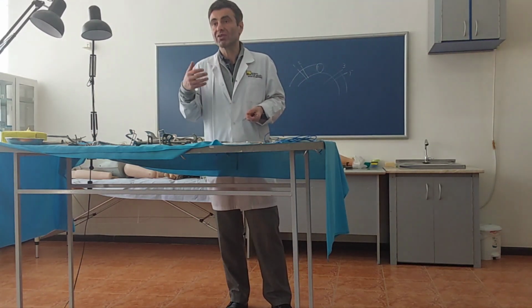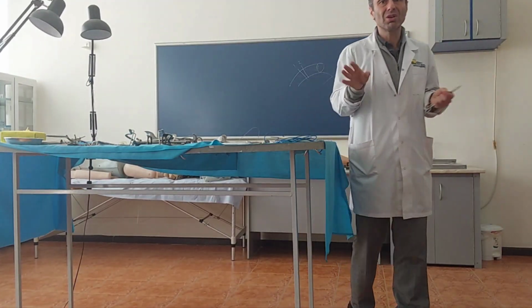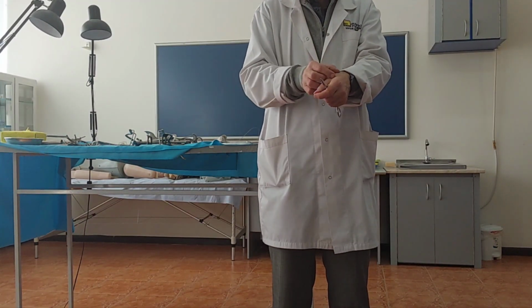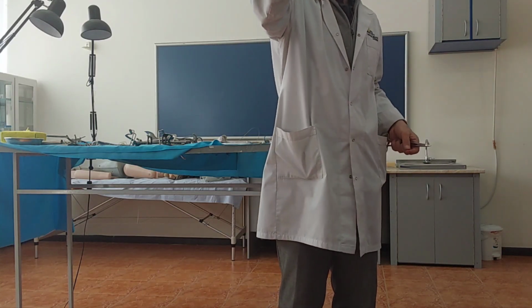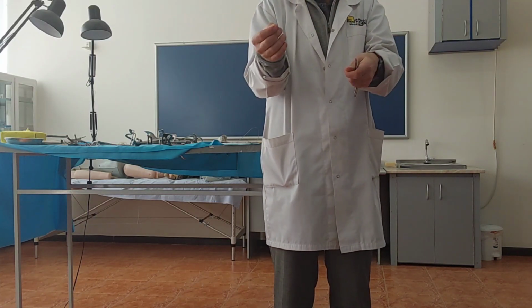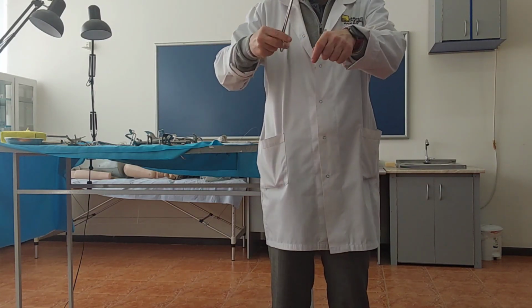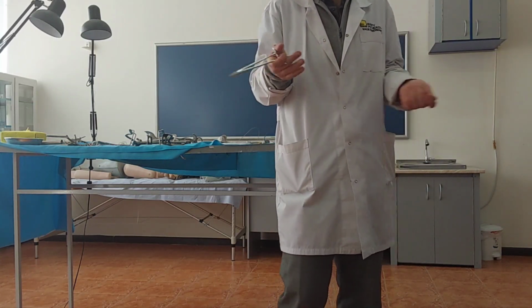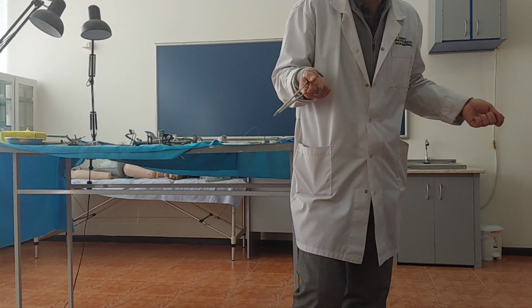In same case, we have staplers which connect things to each other. I have here one broken stapler. You can see it after. I think it's not necessary to show for you. For example, this is margin of the wound. You connected them to each other. You apply the stapler. You push the wire inserted in two margins of the wound and connected margins to each other. Then, if you want to remove it, there is a special remover for this, like the needle holder. You fix it. You push it upwards and it is removed from the wound. After 7 days, we can simply do it because margins of the wound are joined and fused to each other.